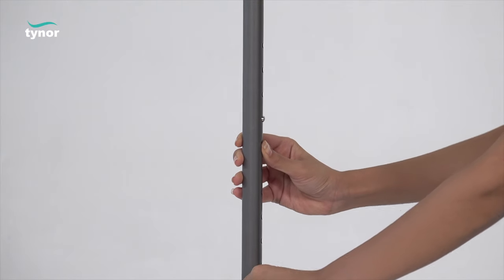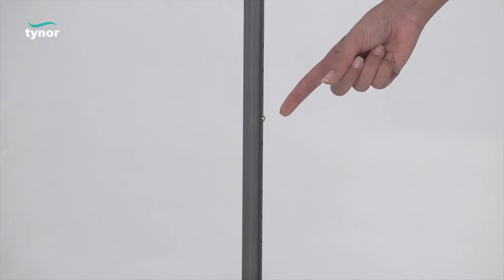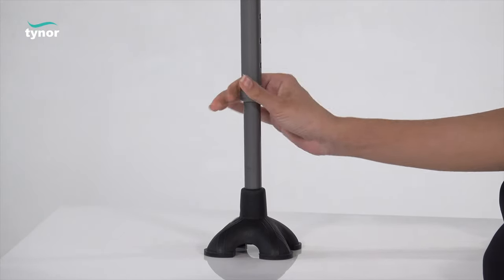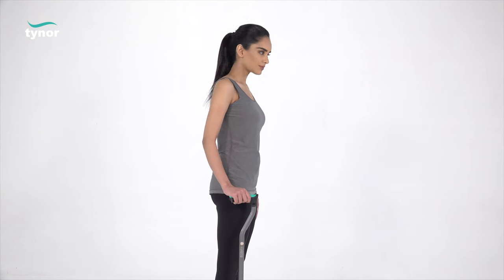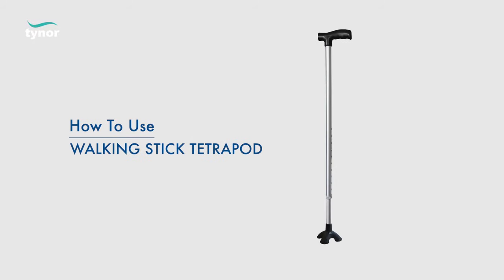Ensure that the spring button is fully engaged in the adjustment hole, then rotate the nut to securely tighten it. Slightly bend your elbow while holding the stick from its hand grip.